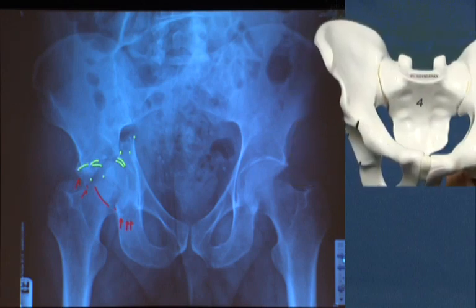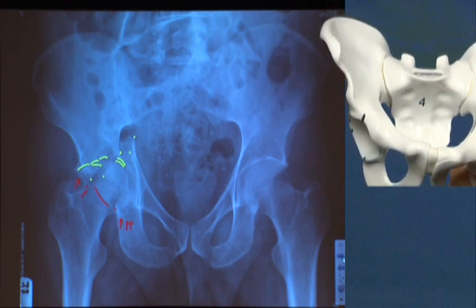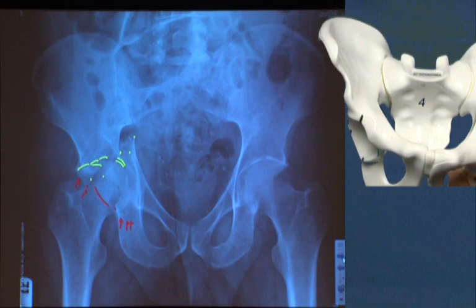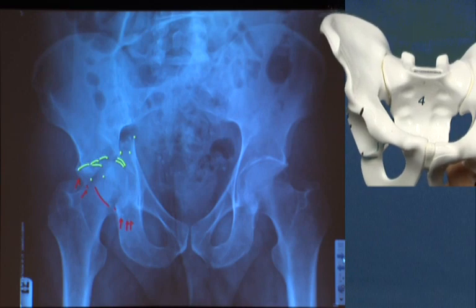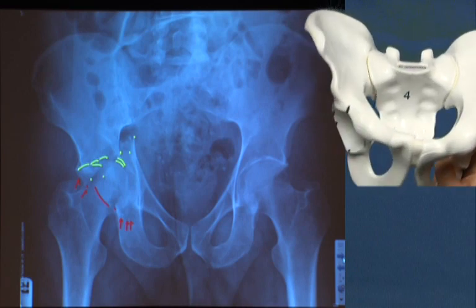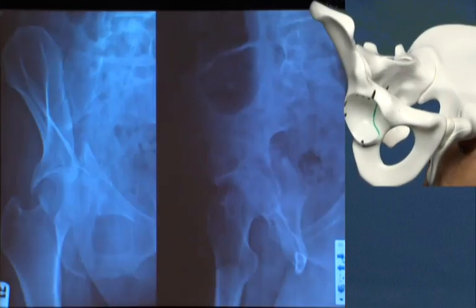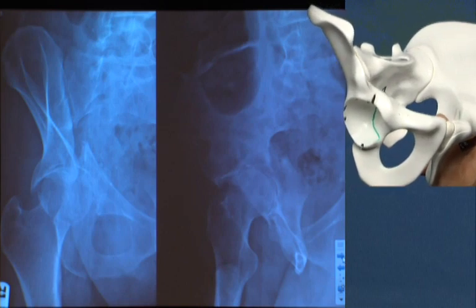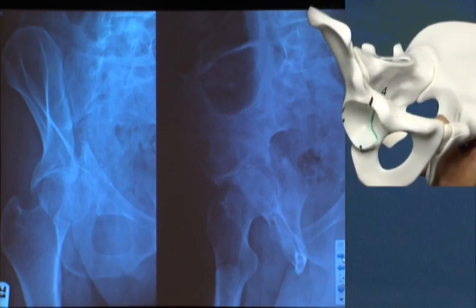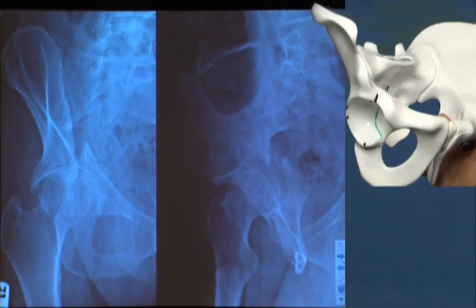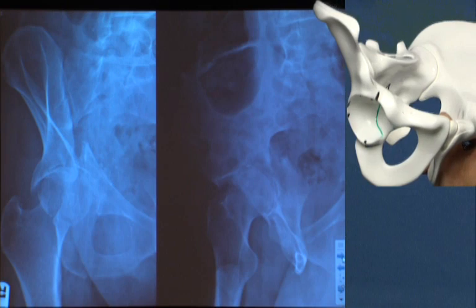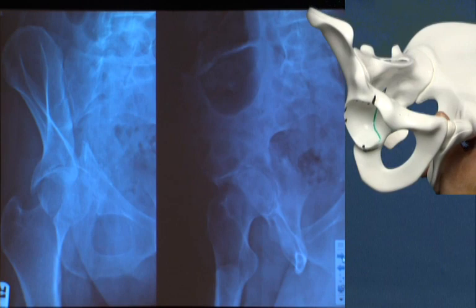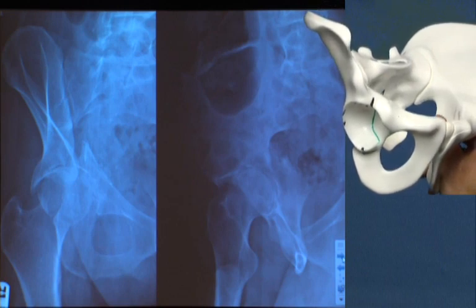In addition to those six lines, I'll quickly look at the iliac wing — I do not see any fracture lines propagating up it — and the obturator foramen, where I do not see an ischioramus fracture or any fractures involving the obturator ring. So we'll go to the obturator oblique view. The radiographic landmarks we're looking at there include an enormous list, but the key ones are the visualization of the pelvic brim and the posterior rim shadow, and we're going to look at those first.